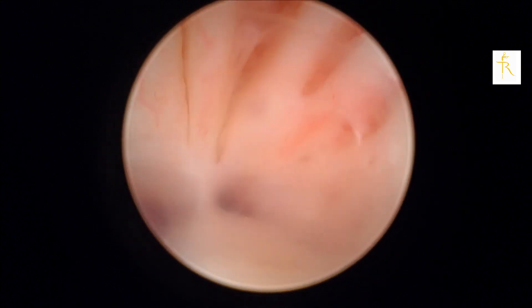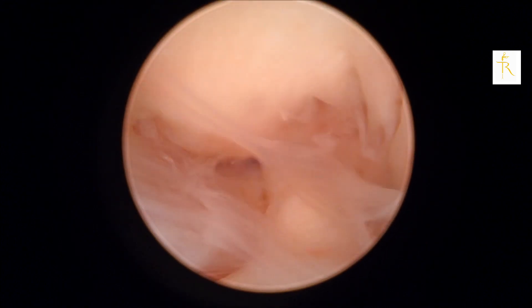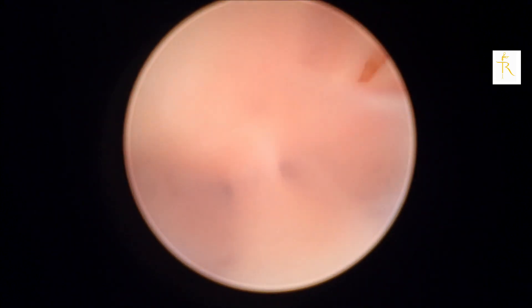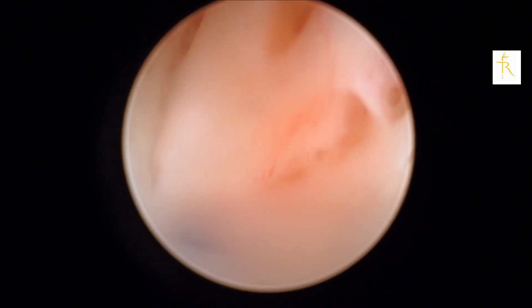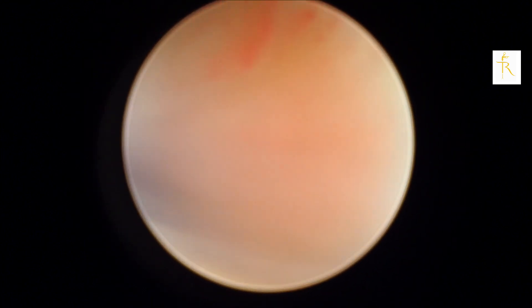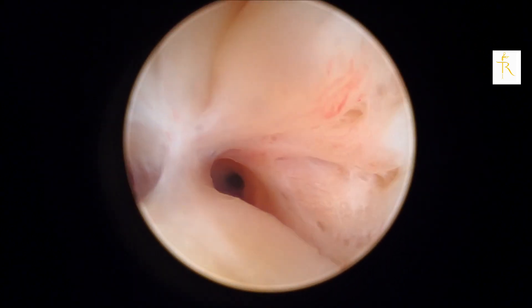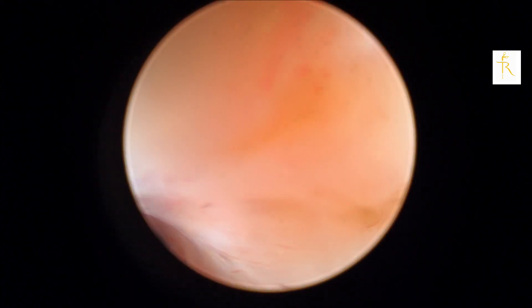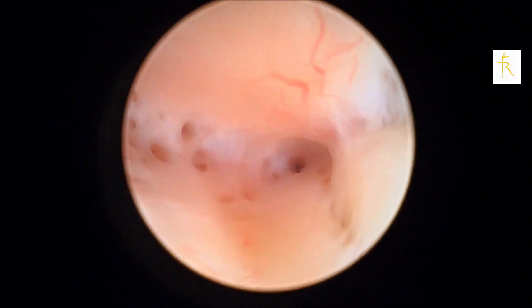Now you can see that there are some adhesions at the os which do not let us go inside the cavity. Essentially, all you need to do to avoid a false passage or a perforation in hysteroscopy is to constantly negotiate by moving forwards and backwards, so that you get an overall sense of where exactly you are and don't go where you don't want to.